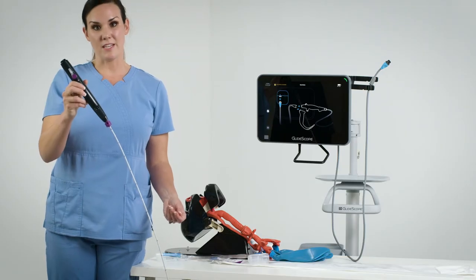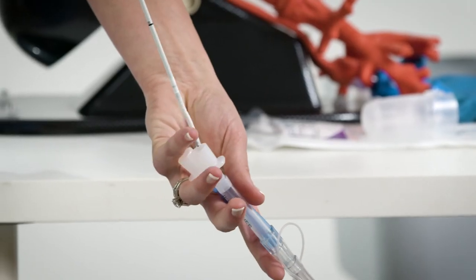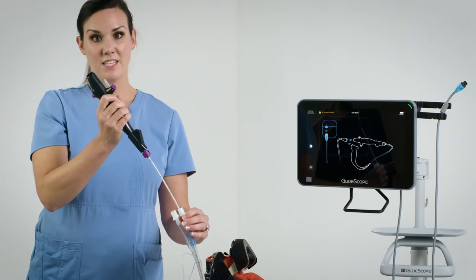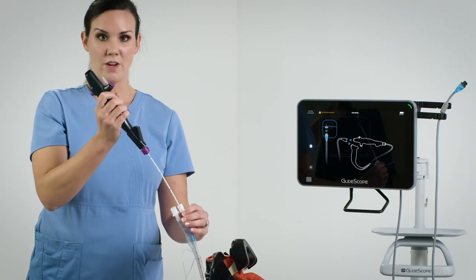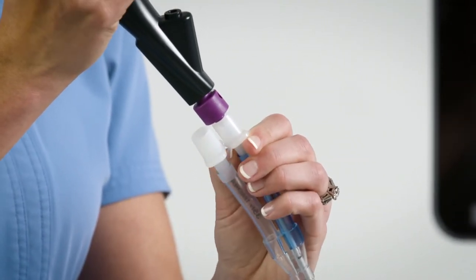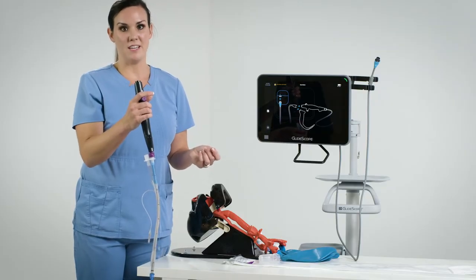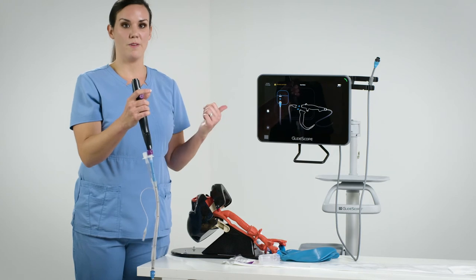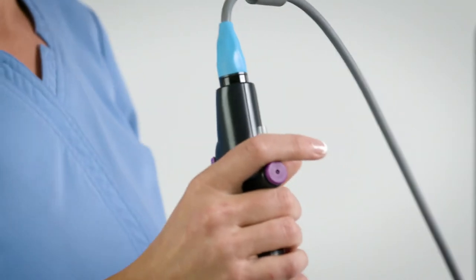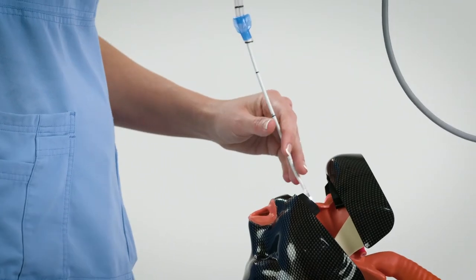I'm now ready to insert the B-Flex into the double lumen tube. You want to keep your thumb away from the lever to keep the distal tip in a neutral position before loading the endotracheal tube. Now I can continue to advance my B-Flex through the endotracheal tube and load it to the top of the scope using its tube retainer. The last step before I intubate my patient is to connect my scope to the Core 15 monitor using the quick connect cable. Now I can see the image on the Core 15 monitor and I can go ahead and start intubating my patient.